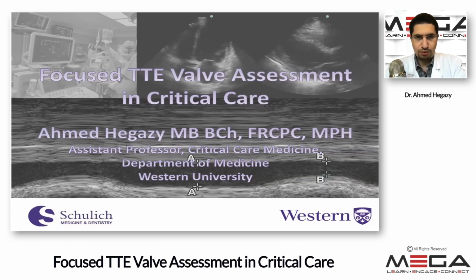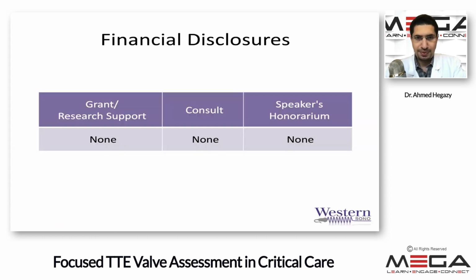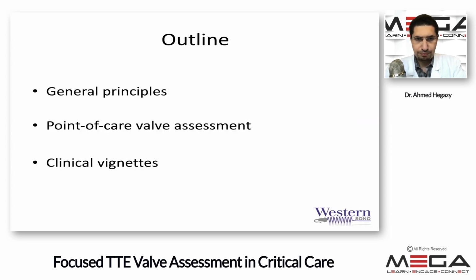So I'm going to talk to you about focused transthoracic echocardiography with regards specifically to valve assessments in the ICU. And to those who attended the last talk, which was 2 weeks ago, we went through the basic views and what you can benefit from when you're doing a transthoracic echo, but we did not cover specifically valve assessment. So that's what I look forward to presenting today. I have no financial disclosures, so I do not receive any funding from any of the ultrasound vendors.